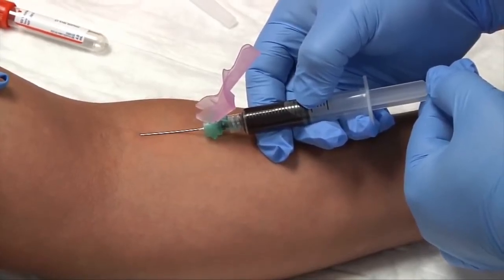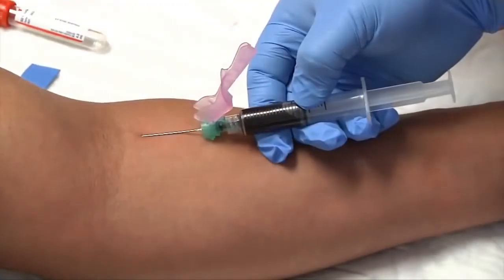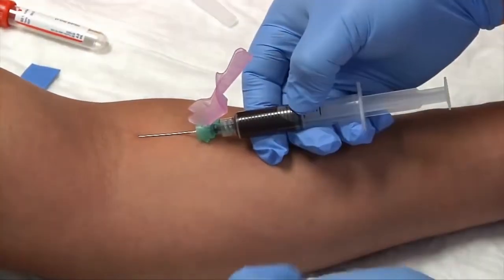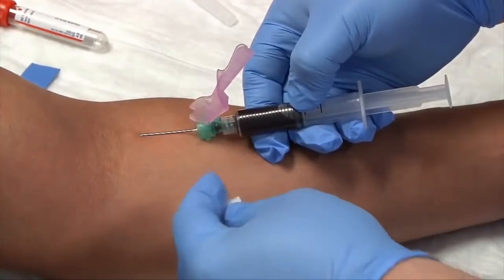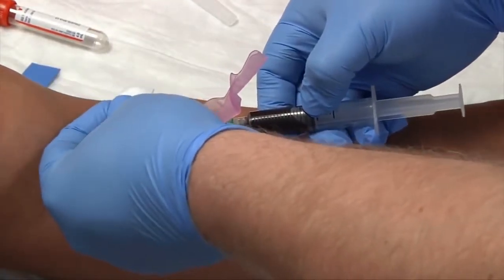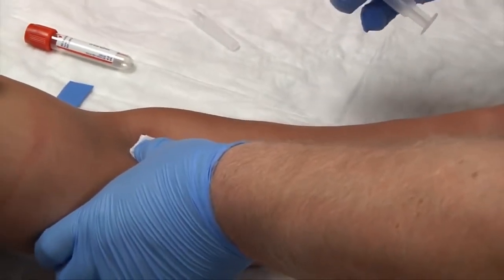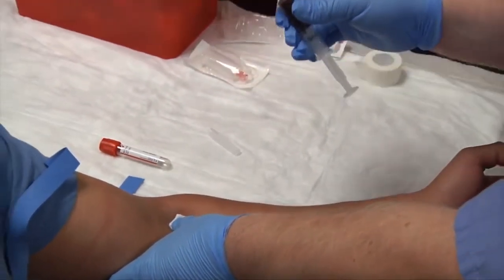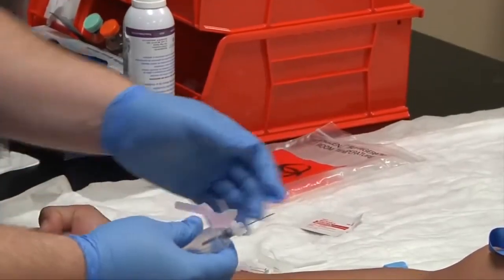Okay. Looks like I almost have my 3 milliliters of blood. So what I'm going to do is I'm going to release my tourniquet, grab my gauze, fold it over once, fold it over twice, pull my needle out, apply pressure, immediately safety cap. In this instance only, we can sit the syringe down, and everything's good with this one.